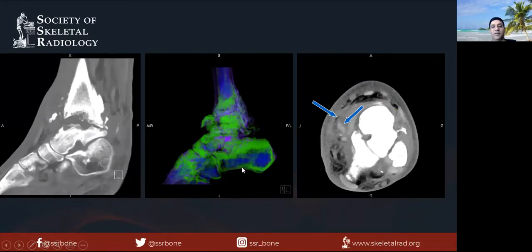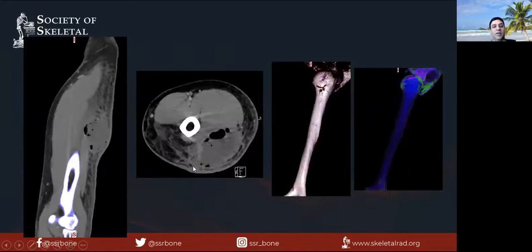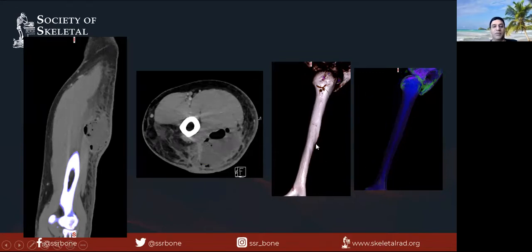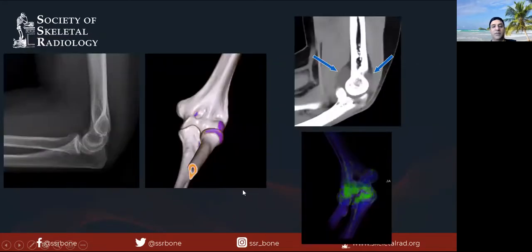There's a lot of active edema around the ankle and hindfoot in this Charcot case. You can also see tendon tears with tenosynovitis. For osteomyelitis: here there's a large abscess with a lot of soft tissue involvement. There's no cortical destruction, and on the bone marrow map there's no bone marrow edema either — so you can be pretty much 100% certain there is no osteomyelitis. We use a lot of these scans in patients who cannot get MRIs, and dual energy helps.